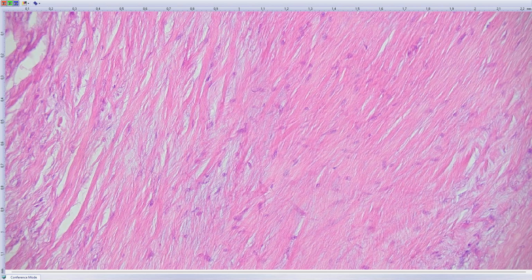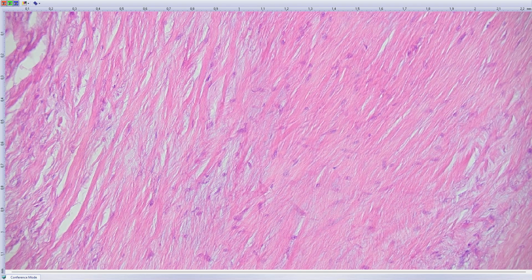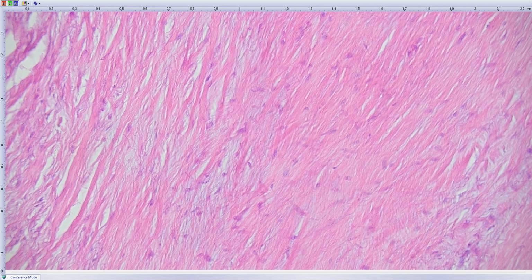I love the clue my father taught me. I don't know if he came up with it himself or he read about it, but he said that this tumor resembles the spermiogram of an infertile male, and I think it's a very helpful clue. Obviously I had to Google how it looks. You can try it, and it really looks similar. The tumor cells look similar in shape and with regard to cellularity and the amount of tumor cells.